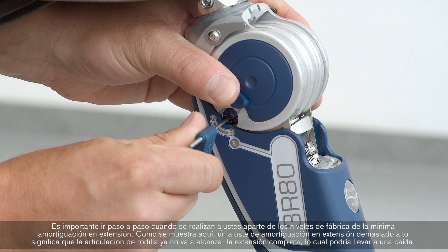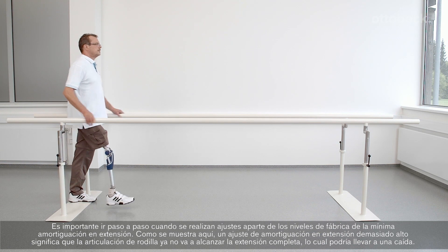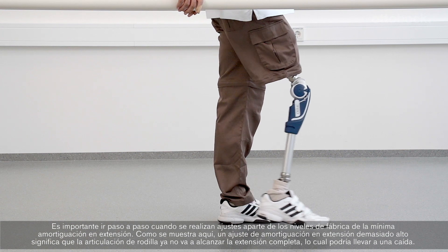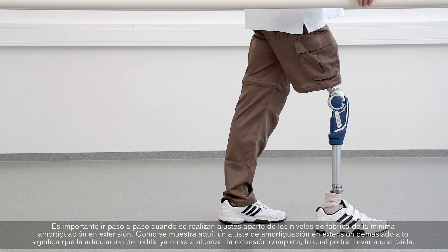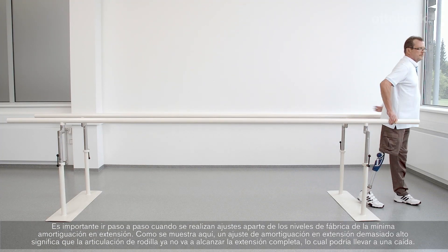It is important to always take small steps when adjusting away from the factory setting of minimum extension damping. As shown here, an extension damping set too high means that the knee joint no longer comes into full extension, which could lead to a fall.